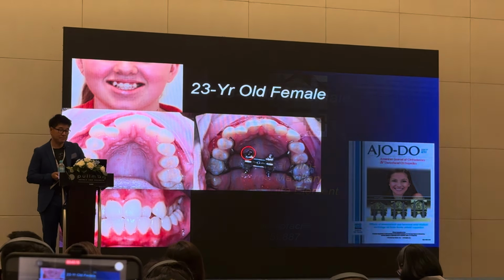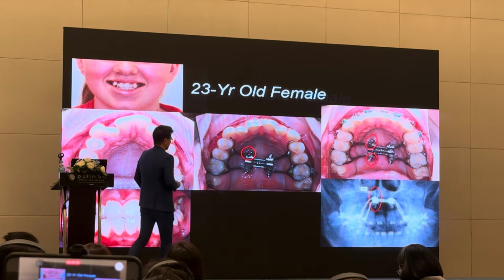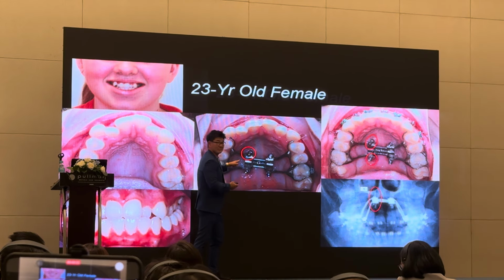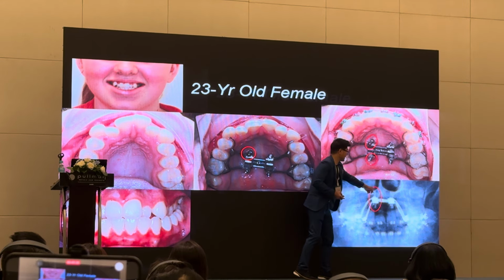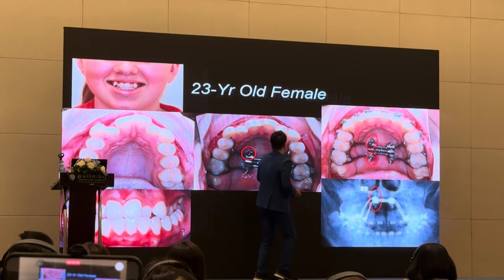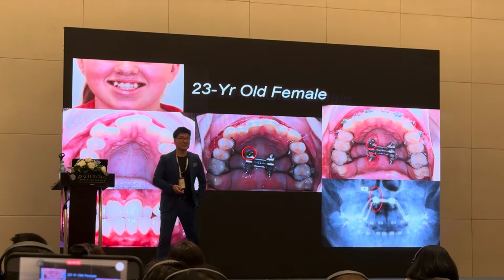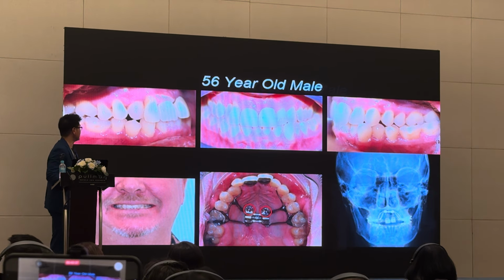So, nice study. Now let's look at some of the failed cases. Look at this one, sticking out, right? Not all the way up. Monocortical engagement. Look at this, screw tipping. Right? And we couldn't split the suture. So, failure.